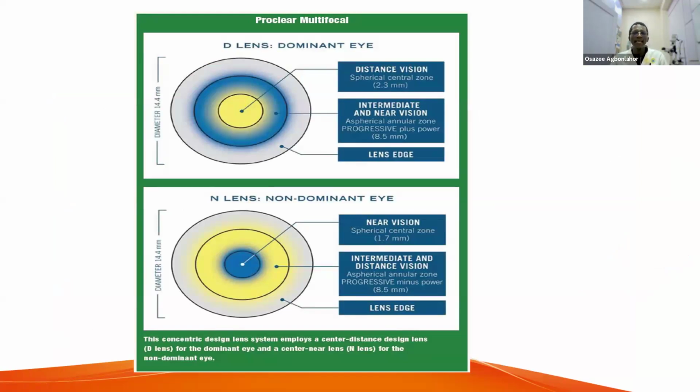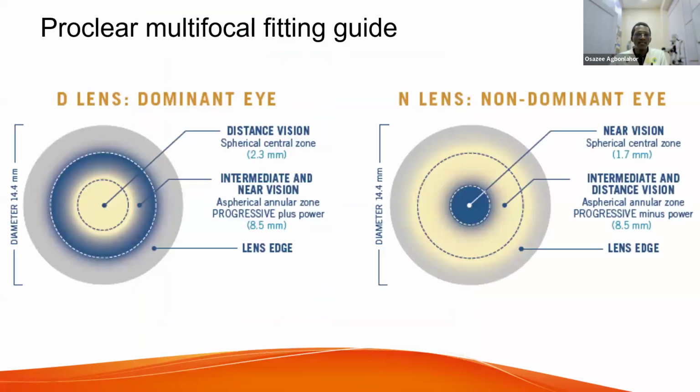All right. So for the sake of this presentation, I have to leave a disclaimer. I am not marketing ProClear. There's no financial commitment there. They didn't promise me any money. I'm just using it based on this presentation. So we're going to be focusing on ProClear, a CooperVision product. They make ProClear. We're going to use them as a case study this evening before we close.